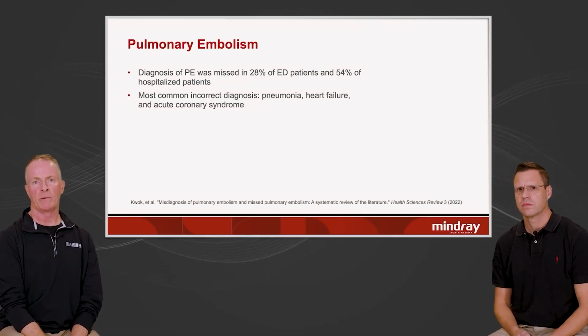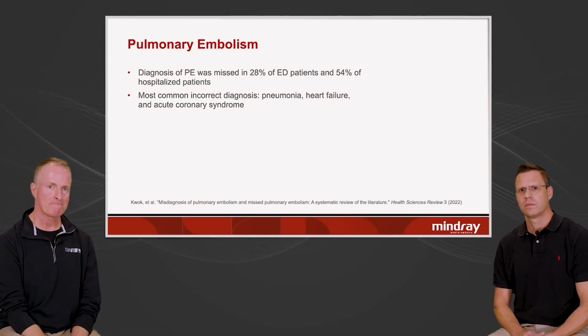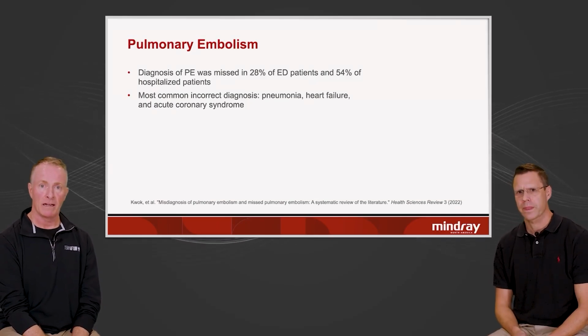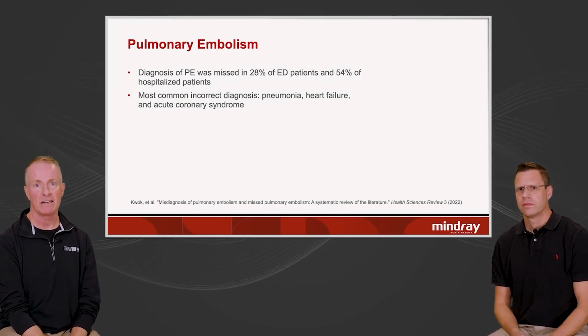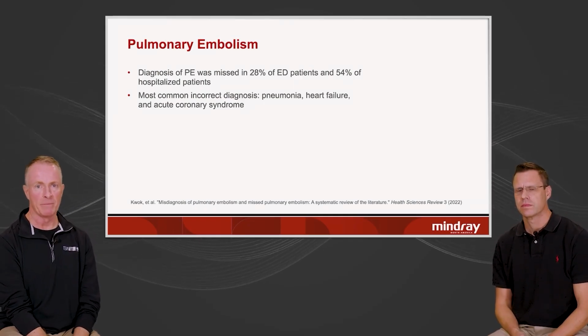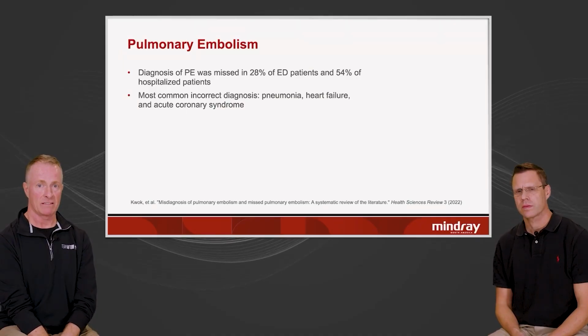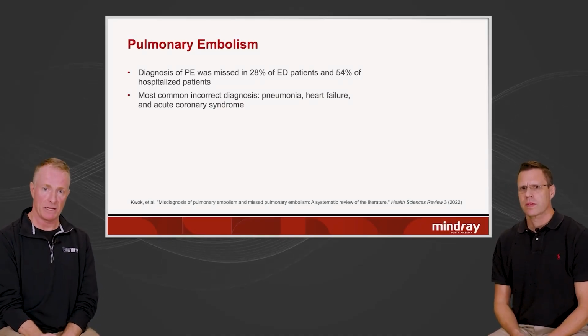Okay, let's talk about pulmonary embolism. Of course, that can cause dyspnea and can be extremely hard to diagnose. This says 28% of ED patients with PE get misdiagnosed. I'm surprised it's that low. This is shocking, 54% of hospitalized patients.